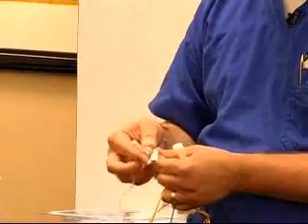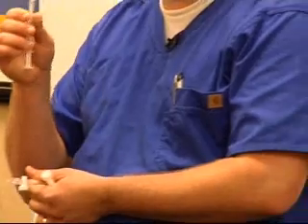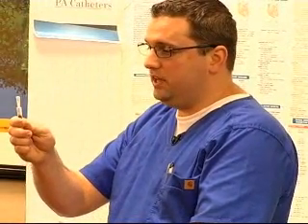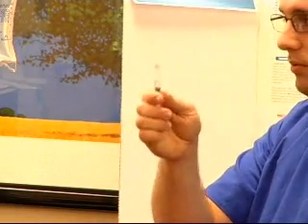Part of the cap is it's a vented cap right up until the blood hits it, and then it becomes a blunt cap because it's got a paper filter on here, and when the paper filter gets wet, then it stops allowing air to pass through or anything. So you would just push the blood up with that last little bit of air that was in there and get blood all the way up into the tip and up into this little tip cap right here, okay? Make sure you've got a real sealed, good sample.